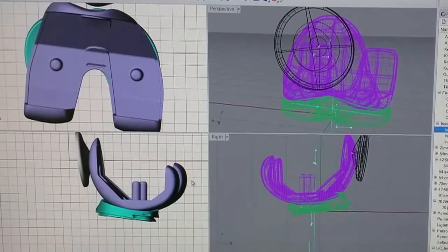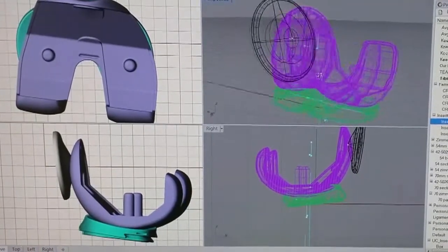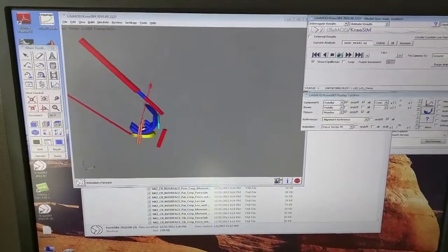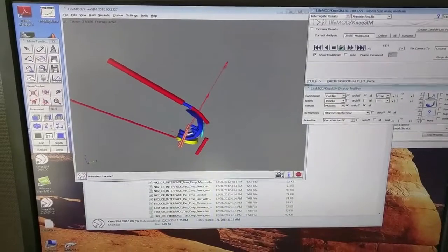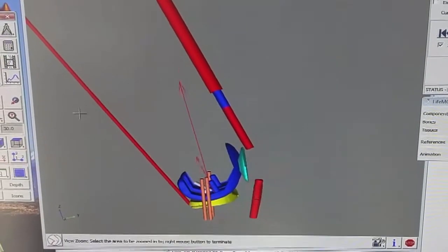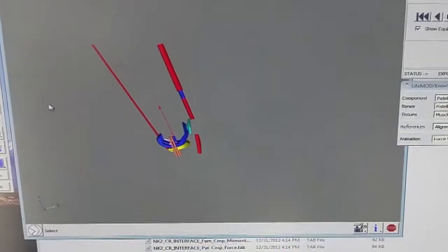One way to do this type of design study is to use different iterations of a design in a cadaver. The issue with this type of analysis is that it will only allow you to get a qualitative understanding of how the implant might behave in the human body. What you can do with finite element analysis is to take the real-life conditions and simulate them in order to get a meaningful, quantitative result.